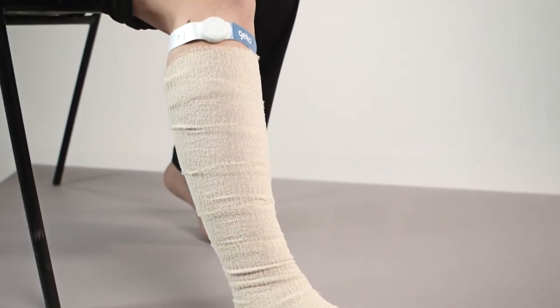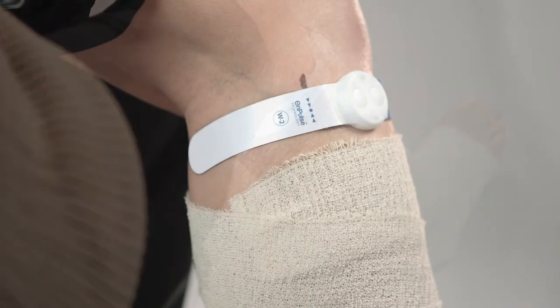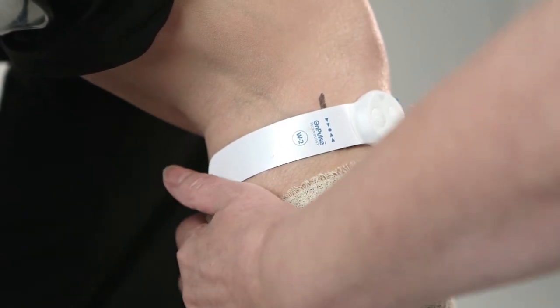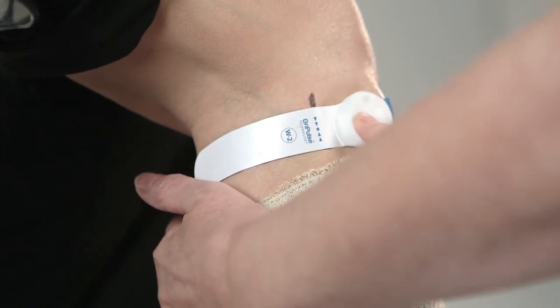Check the patient again soon after fitting the device to ensure that the Gecko is still giving a comfortable and effective level of stimulation, and readjust the level if necessary. To reduce the stimulation levels one by one, use a short press of 0.5 seconds of the minus button. To turn off the device or pause the treatment, hold the minus button down for 3 to 4 seconds.